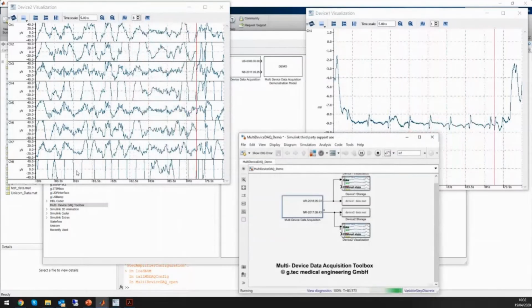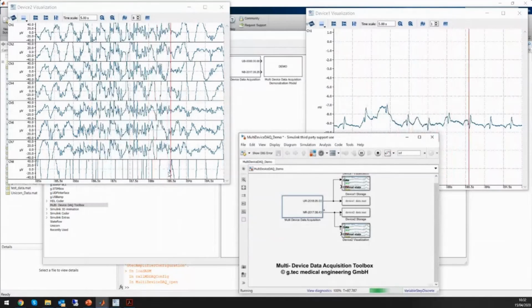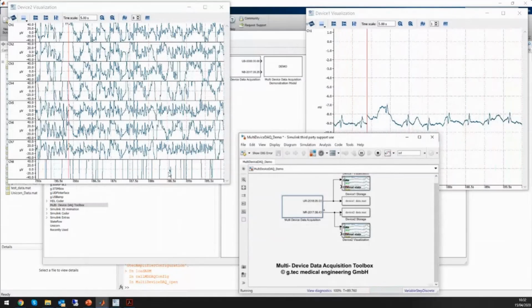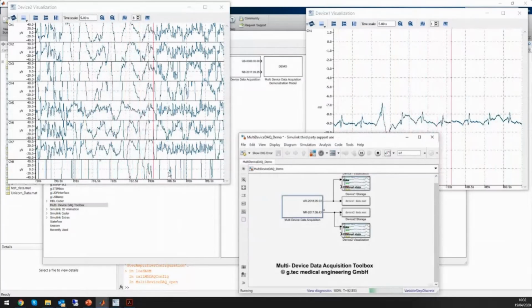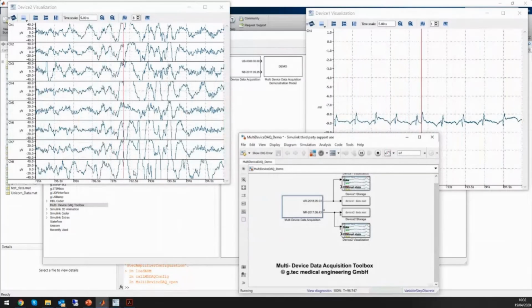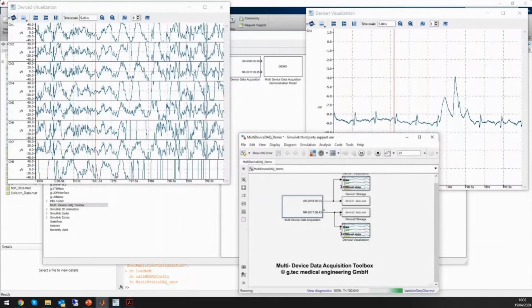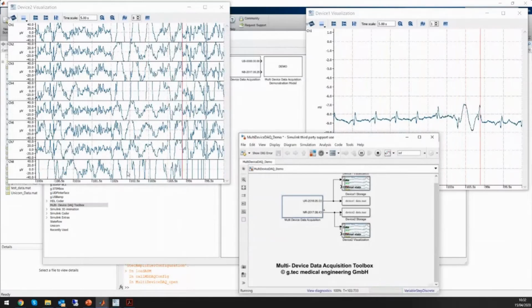So channel 8 is a bit flaky because I've got really thick hair, and I'm not really going to trim it after quarantine. So at the back of my hair, the signal is not really that good. So if I press on it, yep, it works pretty fine.